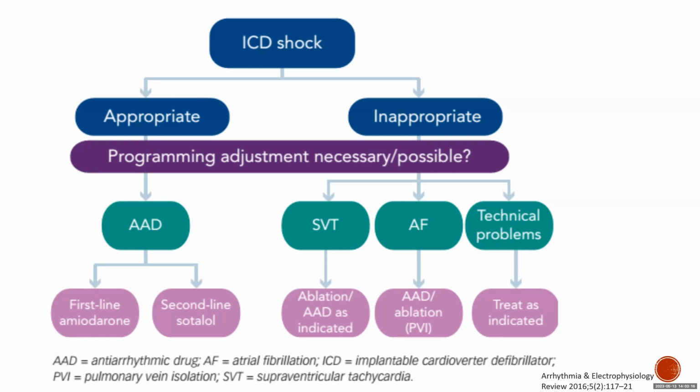We have a question here. If there's someone with ICD and the patient goes into VT and you want to give the patient the external shock, that's a good question. Can you do that? Absolutely. In fact, what you should do, if you walk in the room and patient is getting shocks awake, the first thing you should do is put the magnet on the device. What does the magnet do to the device?